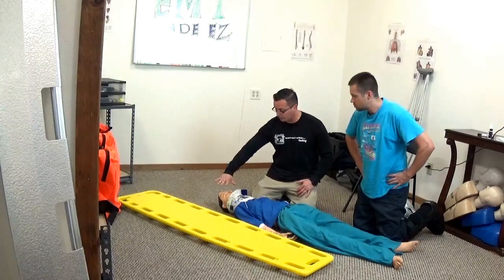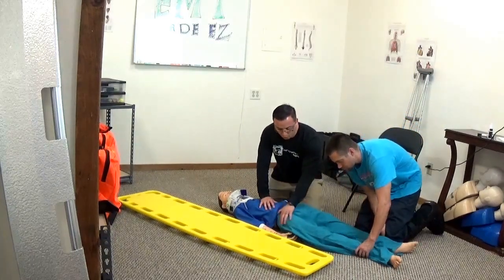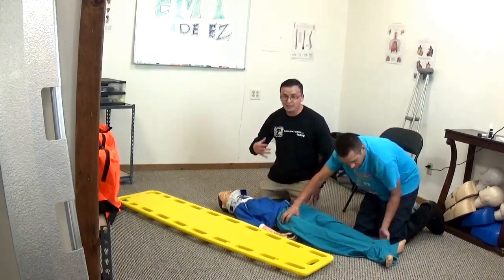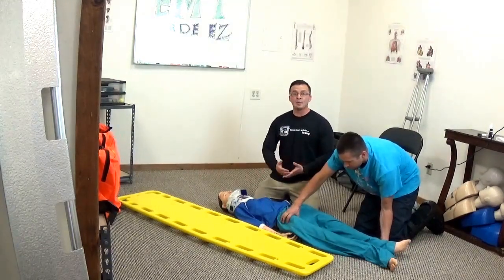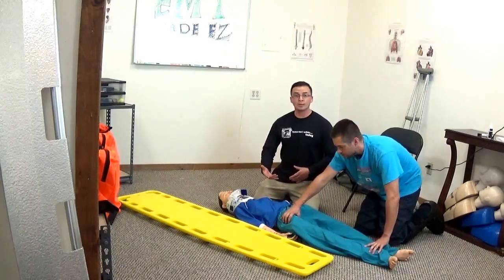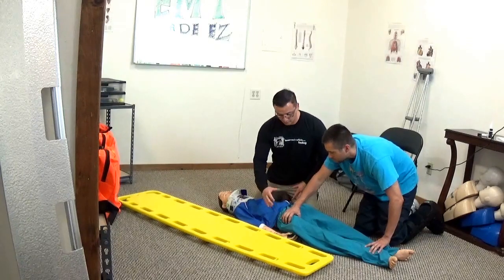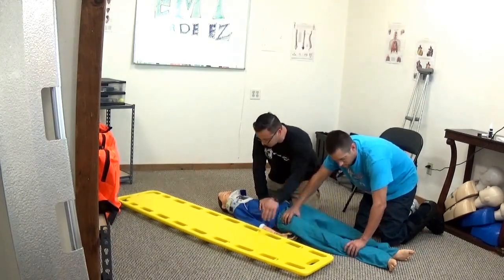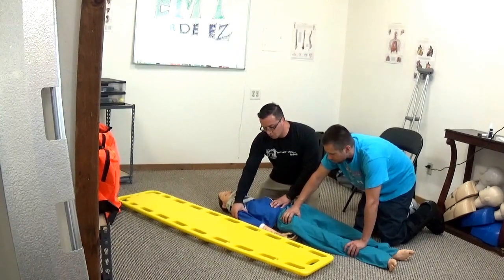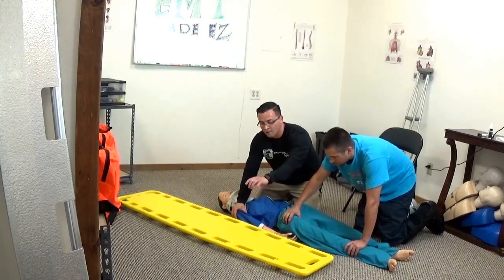One partner is maintaining C-spine on the head. Your other partner gets a handful of calves and a handful of thighs. Now, in the NREMT the proctor will likely pretend they don't know what they're doing — it's your job to correct them and tell them exactly where to place their hands. You'll be on the torso side getting a handful of shoulder and a handful of pocket, with your hand on top of your partner's so you can reach over for the board.